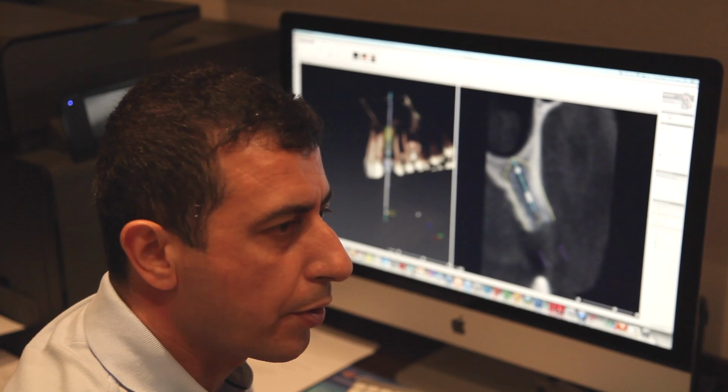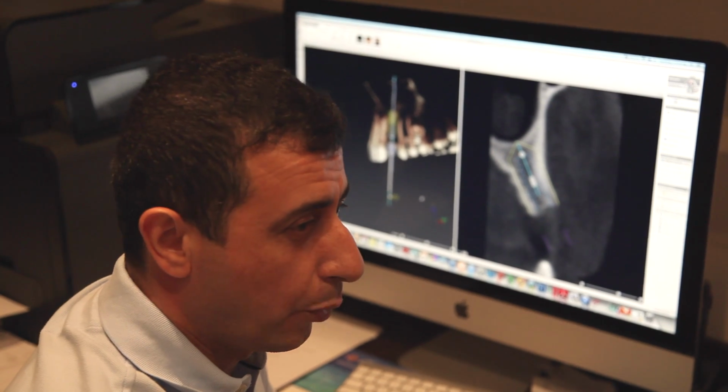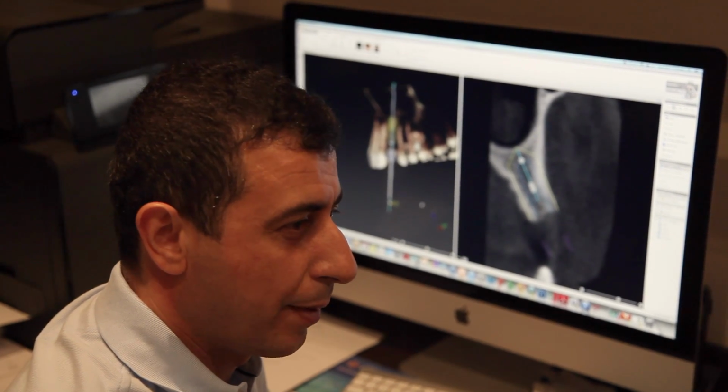And then what I normally do is go through there, measure, and decide what kind of implant we put in there, what angle, what length, and literally do what we call a kind of digital surgery, if you like. Once we're happy with everything, we move on to the iPad, where I can take it with me and show the patient at a separate appointment, okay, this is what we have to do because of such and such. And when we have an agreement, that iPad, believe it or not, will actually control the device that puts the implants in as well. The whole aim is not only to impress the patient, but to make sure that we are that accurate and that delicate about the procedure that we're providing, so we end up with the best product that we can get.